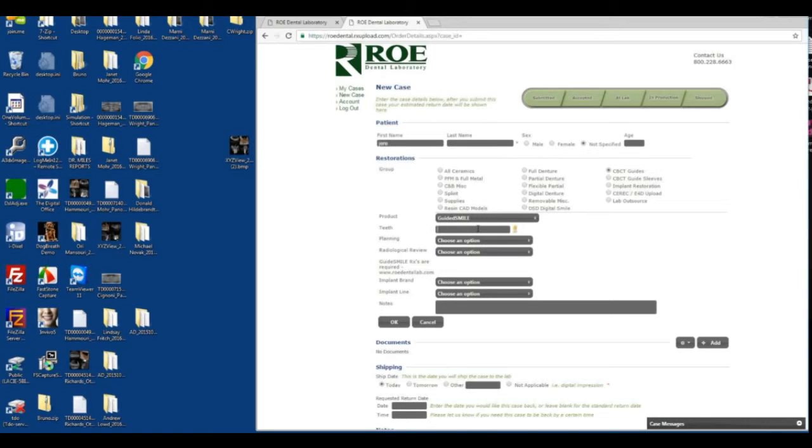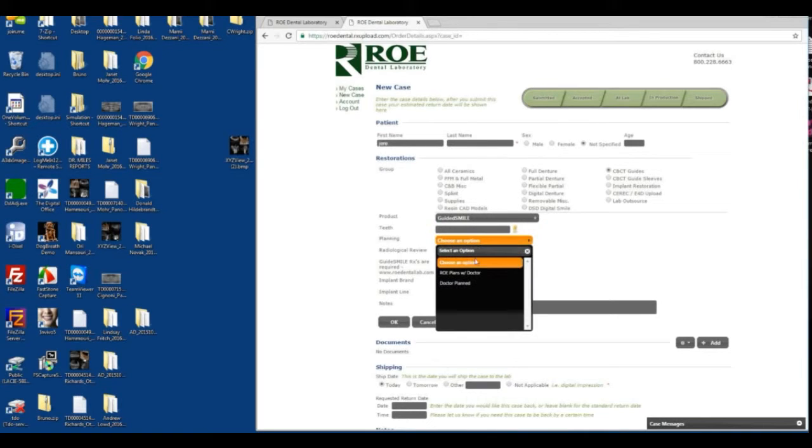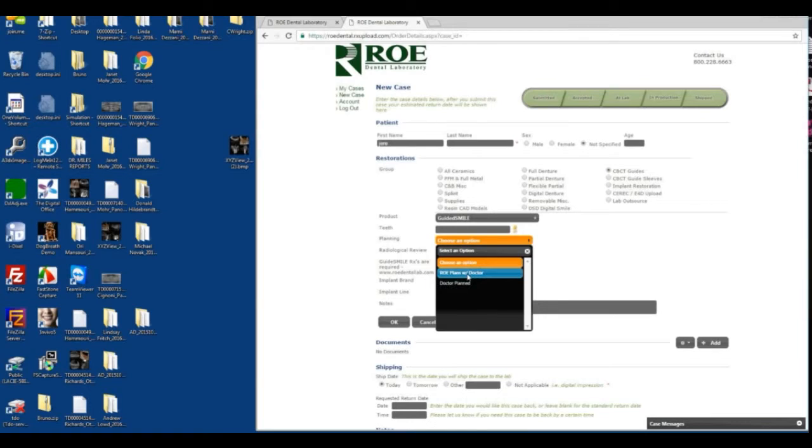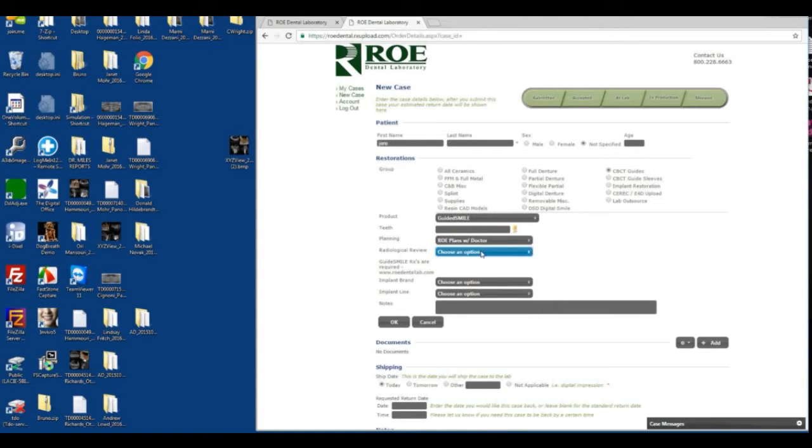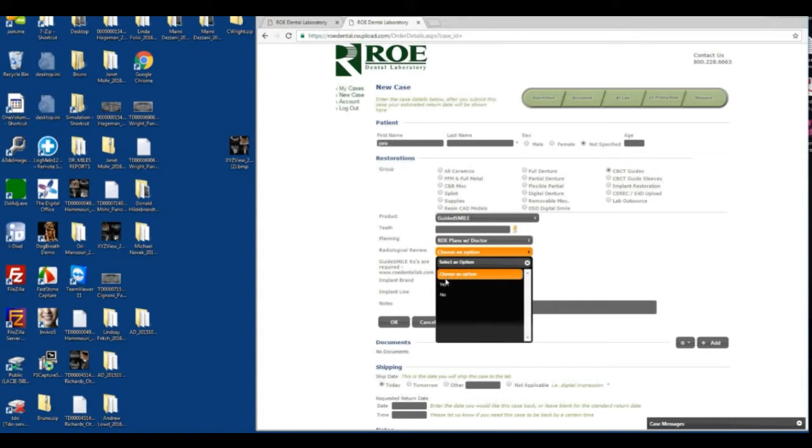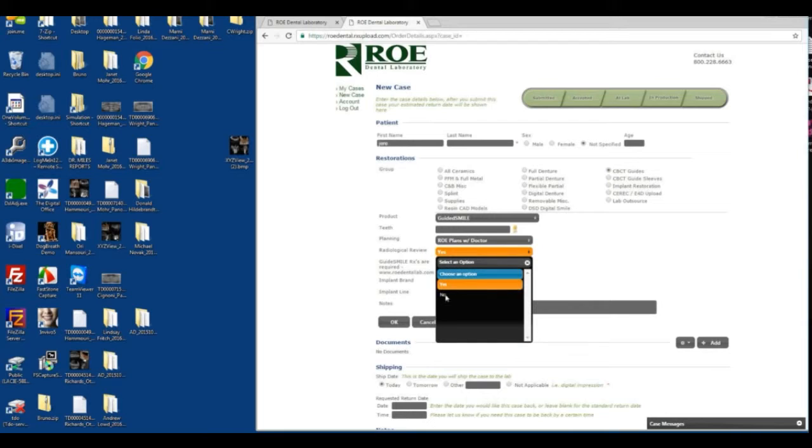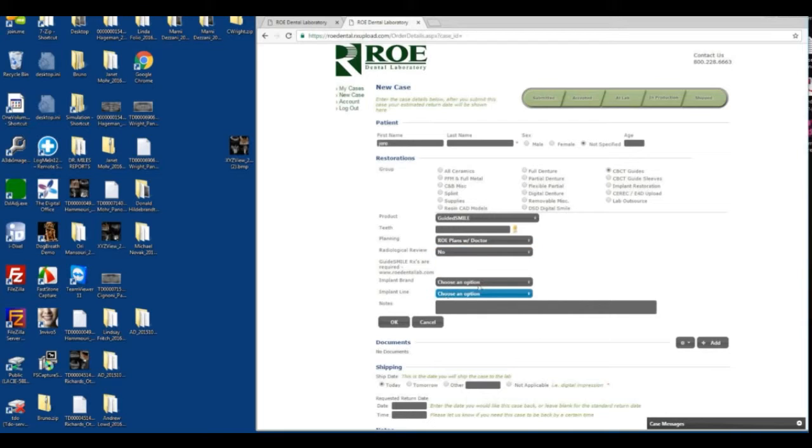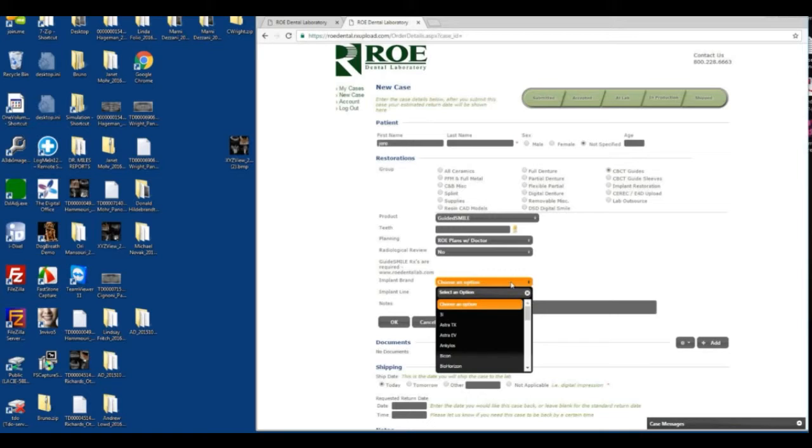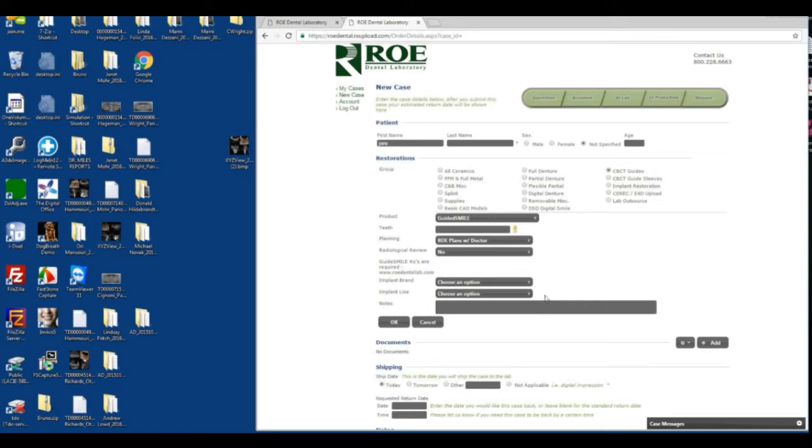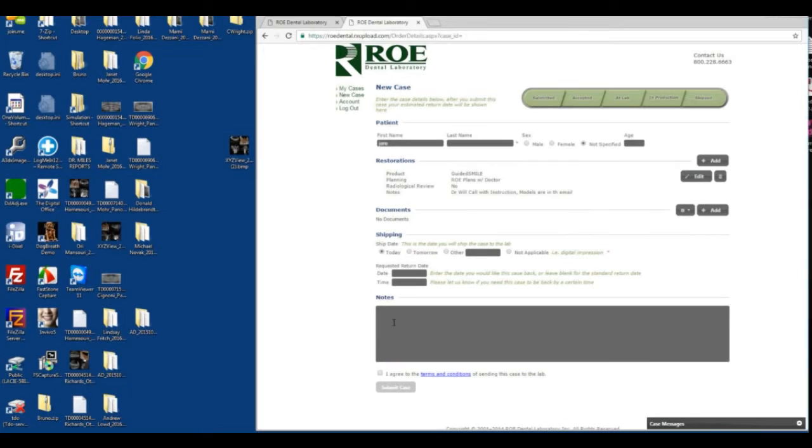We'll determine the teeth later. This is going to be ROE. Doctor will call with instructions and models are in the mail. So we click that, click OK.